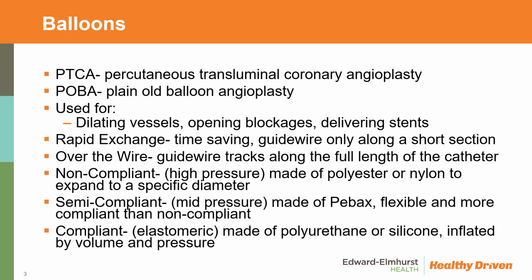Now we've got non-compliant balloons, which are high-pressure balloons made of polyester or nylon to expand to a specific diameter. Our semi-compliant balloons, which are mid-pressure, made of PEBAX, flexible and more compliant than non-compliant, and the compliant ones, which are made of polyurethane or silicone. They're inflated by volume and pressure.